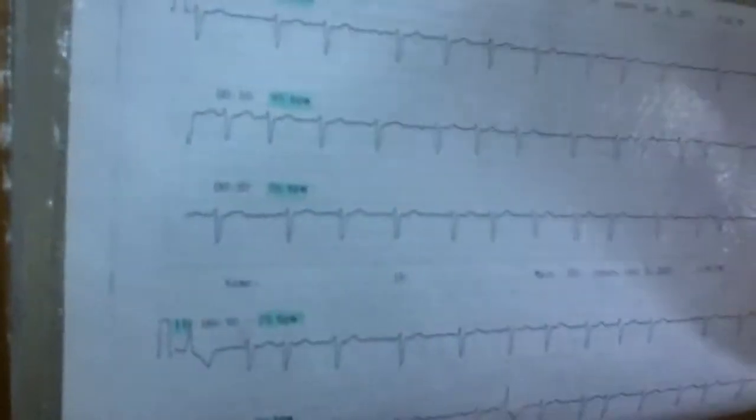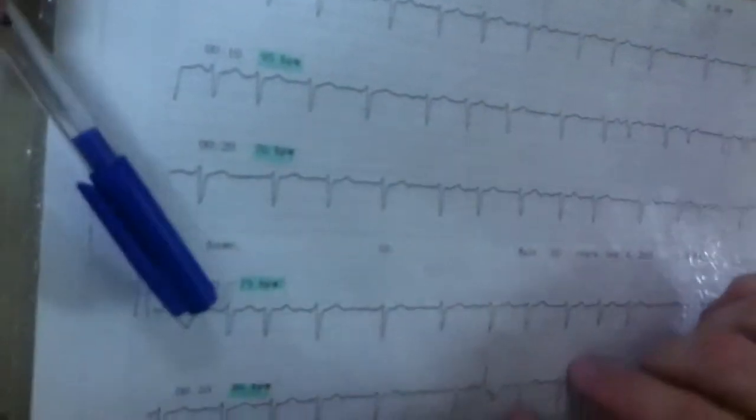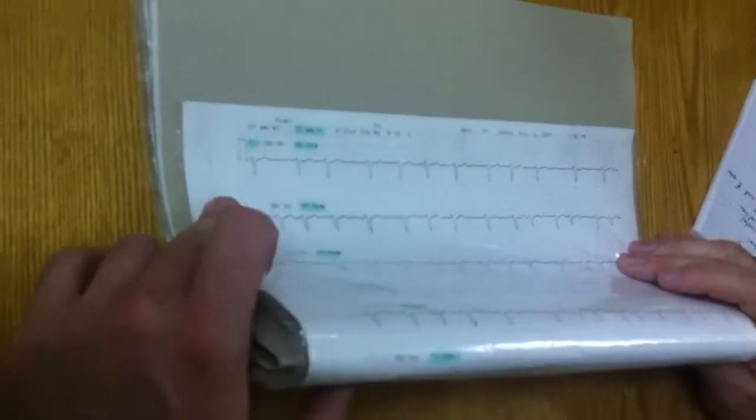It's wide, and it's not like other complexes. So you can say atrial fibrillation with premature ventricular complexes. Also this one. Is it clear? It's not like bigeminy, where each second complex is premature. It's just premature. You can say about multiple extrasystoles, multiple premature complexes, but not bigeminy.